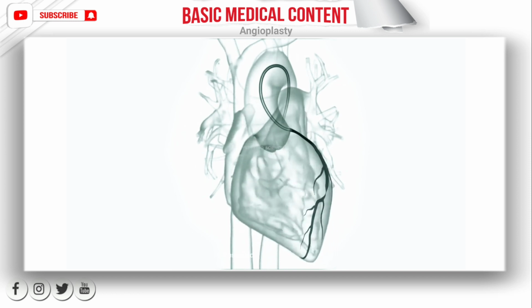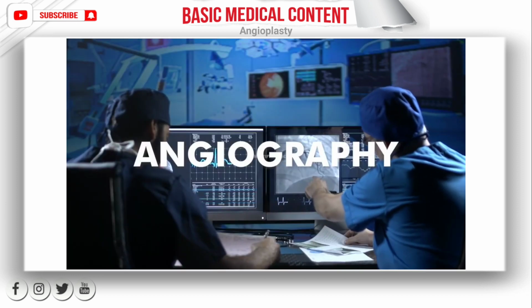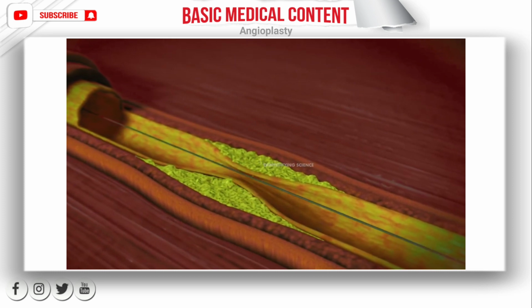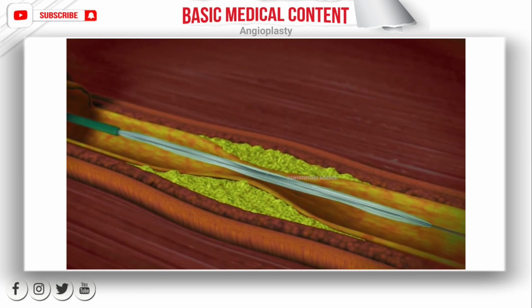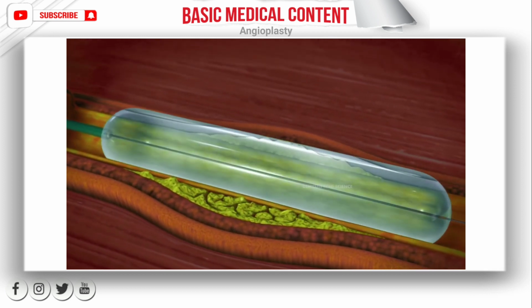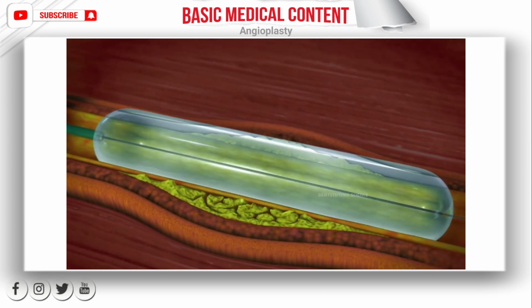Once the catheter is in position, the doctor injects a contrast dye, a process called angiography, which helps identify blockages around the heart. Once they locate the blockages, the doctor inserts a second catheter and a guide wire, usually with a balloon at the tip. When the second catheter is in position, the doctor inflates the balloon, by which the fatty deposits, or plaque, get pushed against the wall of the artery.